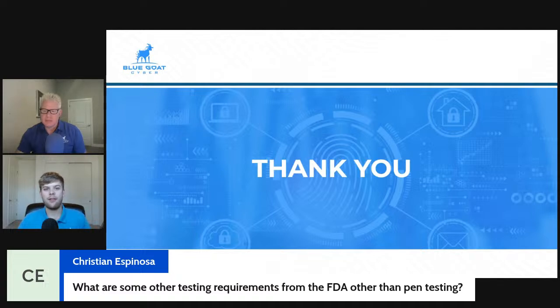And then another area that the FDA calls out as very important for the security testing side of things is software or security requirement testing. So when manufacturers are developing a device, they're going to create the requirements for the device. The functional requirements are going to be what does the device do? That's going to lead into the non-functional requirements, which are how does the device do it? Part of those non-functional requirements will be security requirements. How does authentication work safely? How does data storage work safely? So for any of these requirements, there should be a test built in to verify that the requirement was properly implemented.